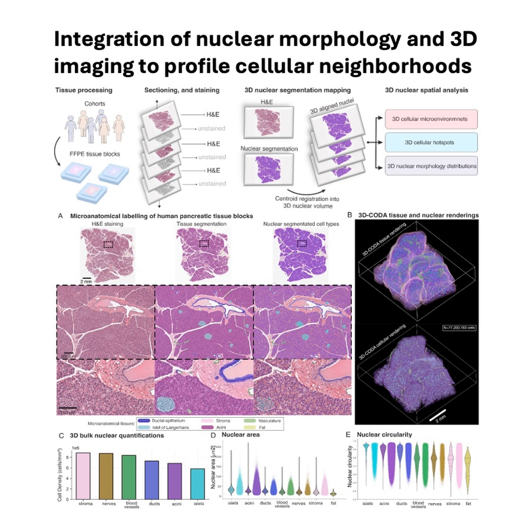Right, you see the detail in each slice. You do, but you completely miss the overall form, the curves, the actual depth, how the different parts connect in 3D space. You wouldn't know if a bump on one slice connects to something big or if it's just a tiny speck. Precisely. And that's kind of what happens with 2D tissue samples. We get details, but we lose the context, the architecture. It really is like trying to navigate a forest using just a single leaf. Yeah. And if we connect this to the bigger picture, like you said, disease progression, cancer cells invading, immune cells clustering. Immune responses, changes in cell communication.